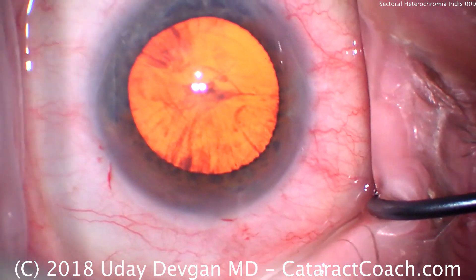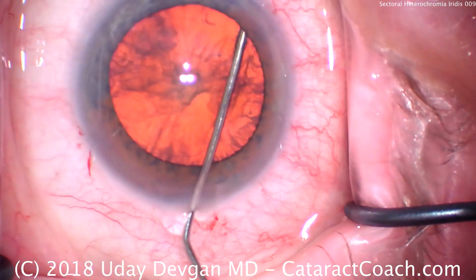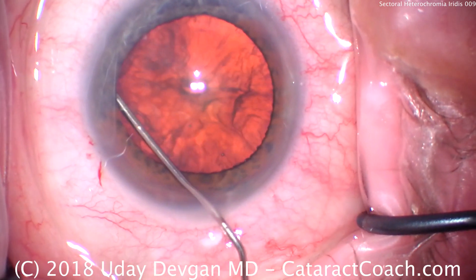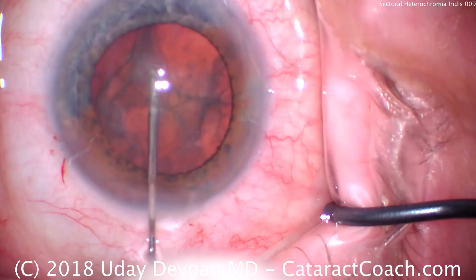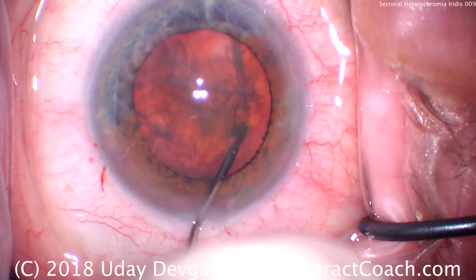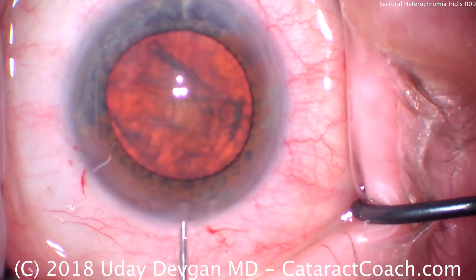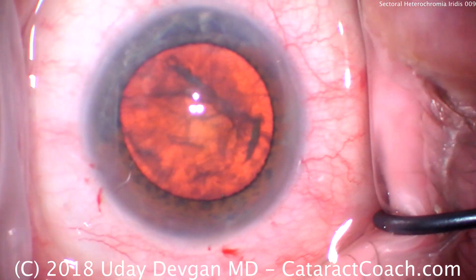We're going to do some hydrodissection here, using some balanced salt solution on a blunt cannula. There's a good fluid wave. Note that we do lose viscoelastic when this happens — viscoelastic comes out of the incision. After a couple of waves, let's try to rotate. When the nucleus spins, we know it's going to be very much free from the capsule. A little extra viscoelastic going in there to protect the endothelium.